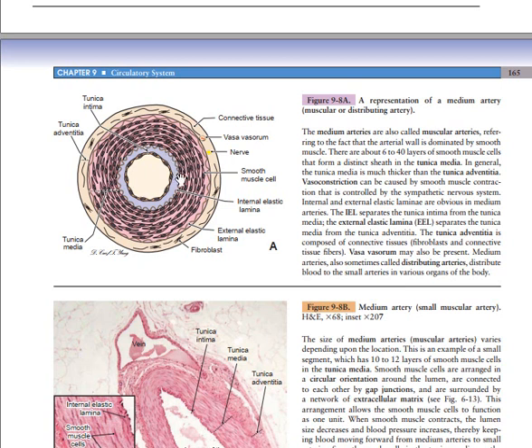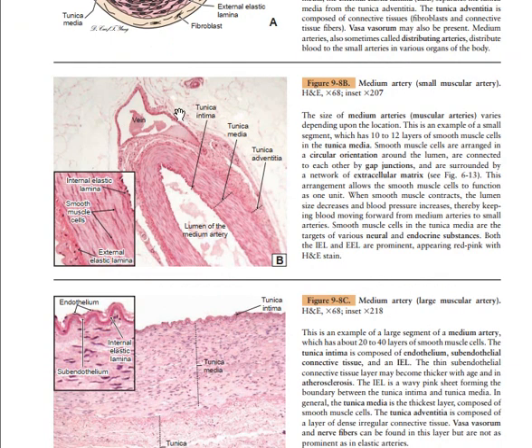So you have your tunica media, then the internal elastic lamina inside, still on the tunica media. So this is the intima, then the media having the internal elastic lamina with multiple layers of smooth muscle, which can vary from 6 to 40 layers, depending on the smooth muscle involved. Then we have the tunica adventitia, which consists of the external elastic lamina and then the connective tissue. Is it clear? Now this is a histologic section with the hematoxylin and eosin stain.